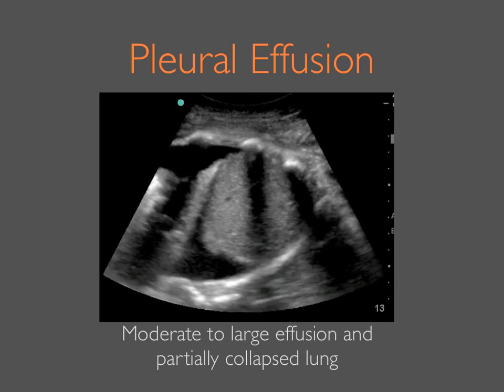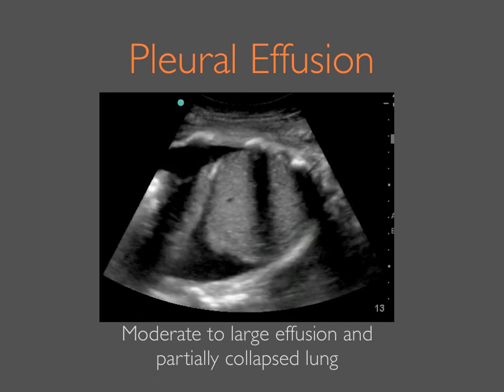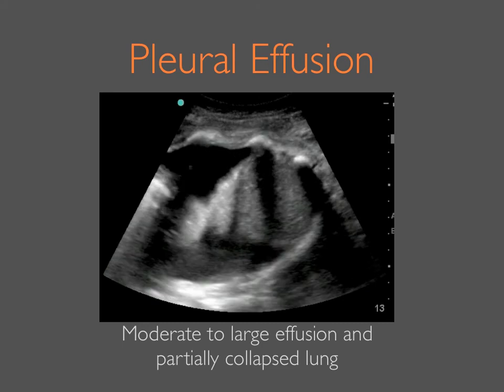Let's discuss the important points to remember when using ultrasound to evaluate pleural effusions. First, as a general principle, fluid is well visualized by ultrasound, which is sensitive and specific for detecting pleural fluid. Note that the diaphragm is often higher towards the head than many anticipate at first. Identify the diaphragm as your main landmark. If you don't see it, try looking slightly more cranial to find that diaphragm.